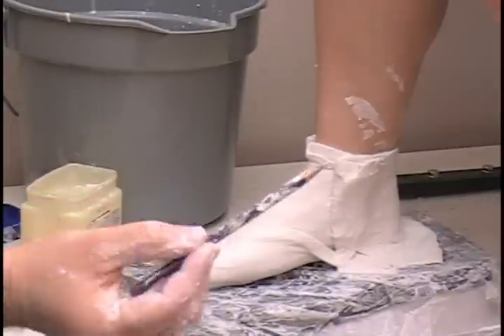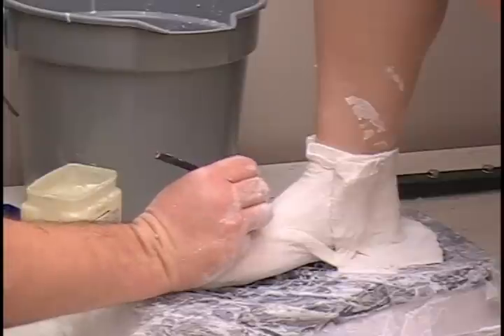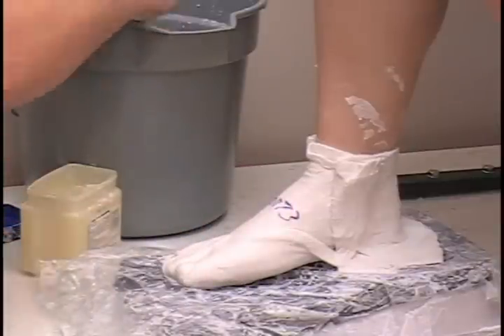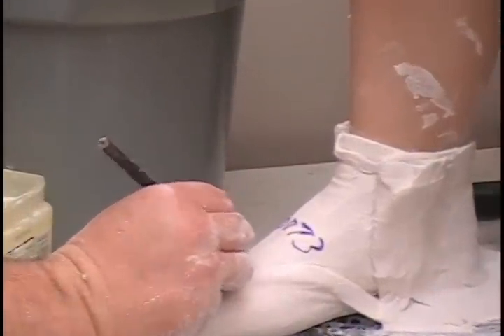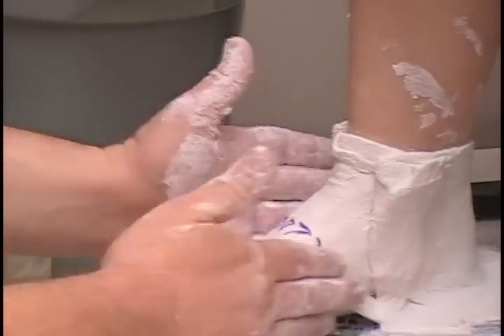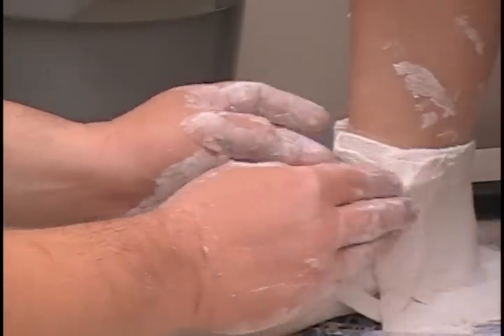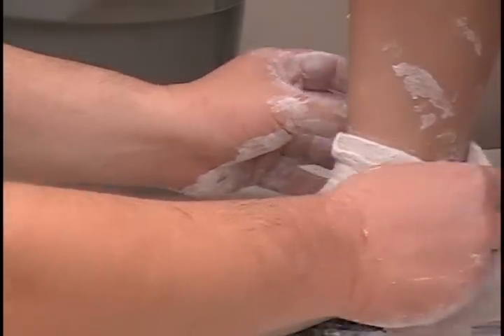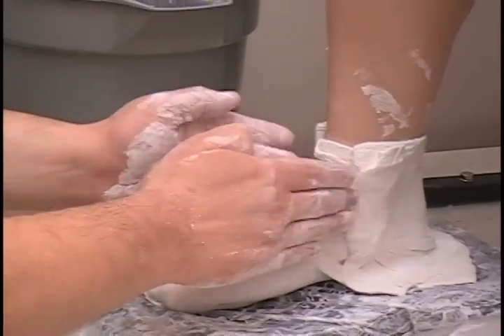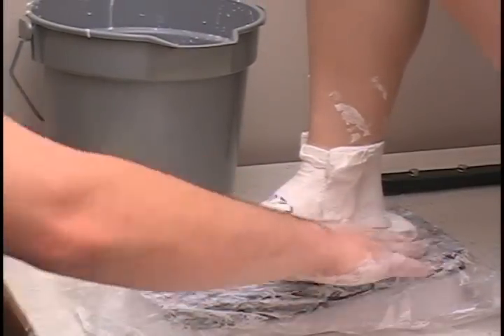We will let that set for a second. With the indelible pencil, quickly put the patient's name or number — her number is 0073 — and also put today's date on it. As this starts to set up, a great idea is to lightly pull the cast back to loosen it up a little bit, making sure you bring it right back into place. That makes it easier to get off once it firms up completely. Massage it back in, and give it a few more minutes to set up.